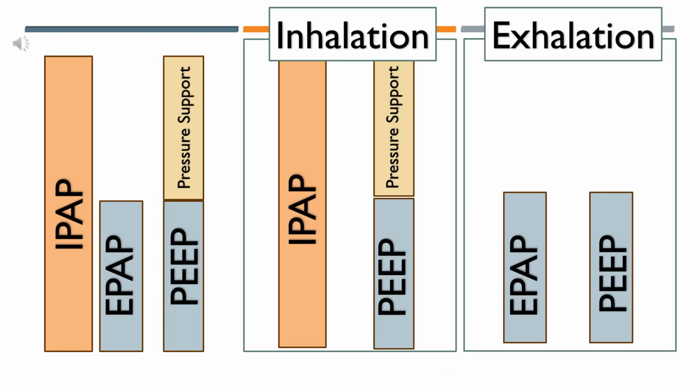Let me just clarify. The difference with the pressure support is the pressure added onto the PEEP, while the PEEP is similar to EPAP as it is a constant pressure.